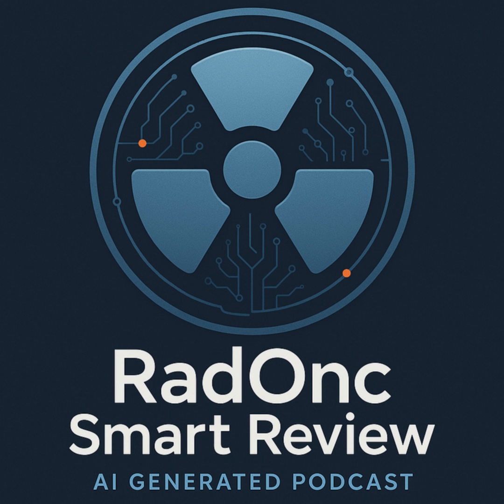Okay. And the doses from these different imaging methods, that's important, right? Hugely important. Need to know the ballpark figure. So regular kV planar ports, just 2D X-rays, very low dose, less than 1 milligray, so less than 0.1 centigray. Minimal. Okay. Kilovoltage cone beam CT, kV CBCT, the 3D kV scan, that's more typically 1 to 5 centigray per scan.